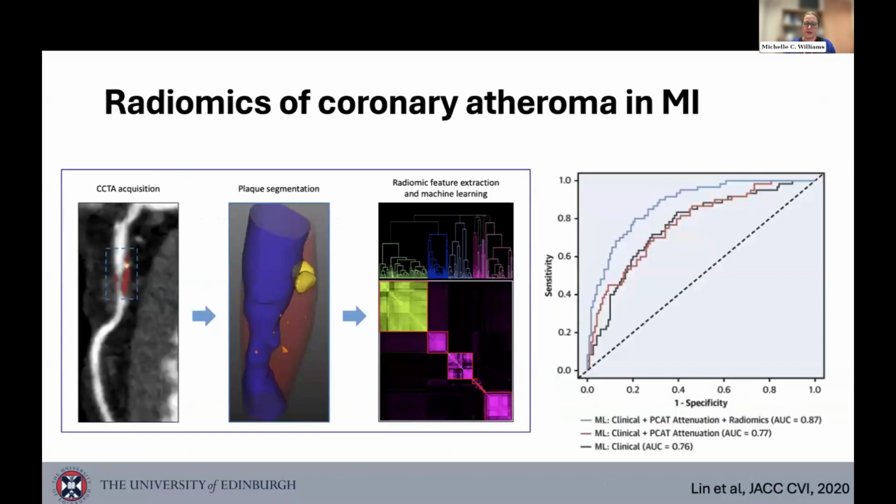that going forwards. Another next thing to do with coronary artery disease is radiomic analysis. It's no longer just about attenuation. We can drill into these plaques and drill into the CT images in much more detail and get these additional texture-based features and other features that we call radiomics.